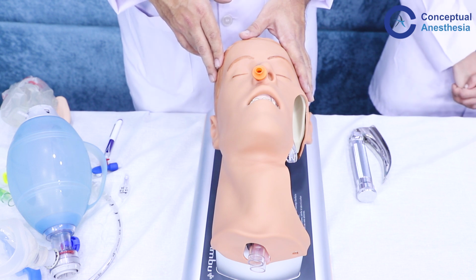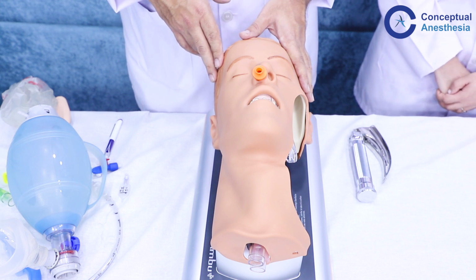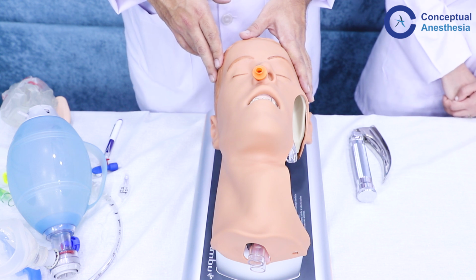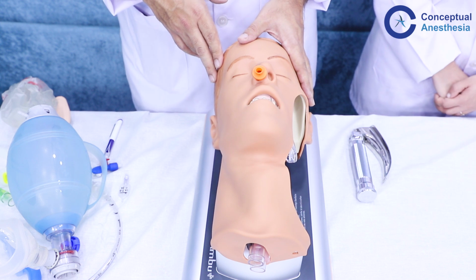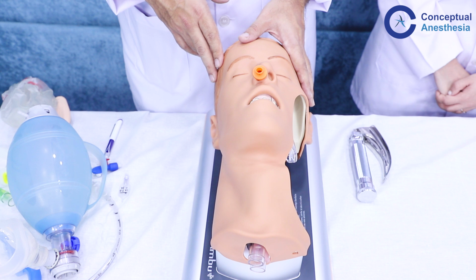So this oropharyngeal airway can be used for three things. Firstly, to open the airway. Secondly, it's a route to do suctioning. And thirdly, it can also function as a bite block. Whereas the nasopharyngeal airway can only act as a suction mechanism as well as opening the airway.